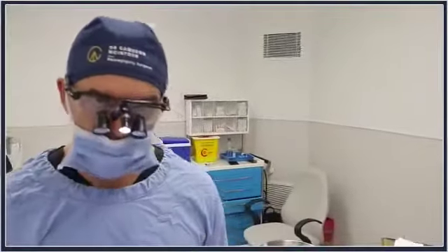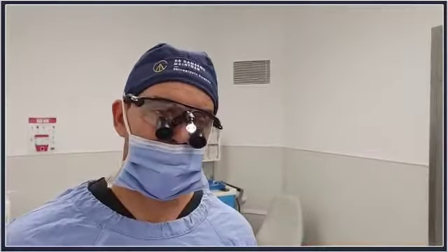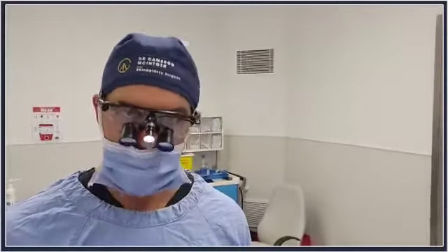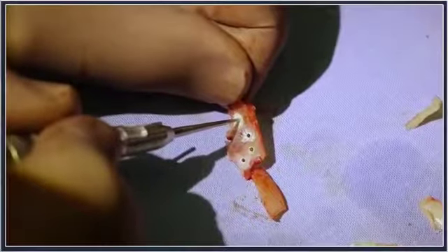Okay, so we finished the case. I'll show you now with the camera what it looks like, but the important thing is that we had to do is first remove the septal deviation and the septal spur, then re-approximate the septum to the right of the anterior nasal spine and the maxillary crest, and then I actually had to use some vomer bone, which I drilled through little holes to actually straighten that out completely. So everything's straight now, I'll be able to breathe better.